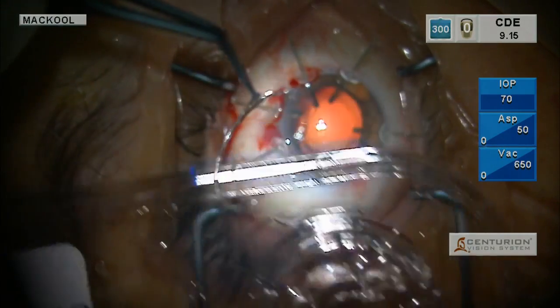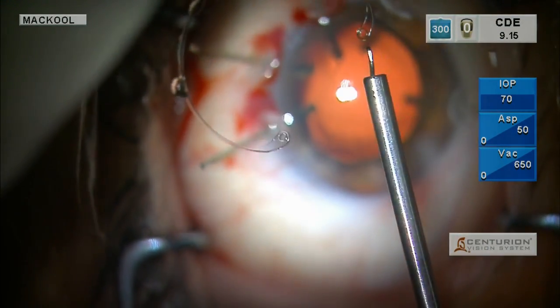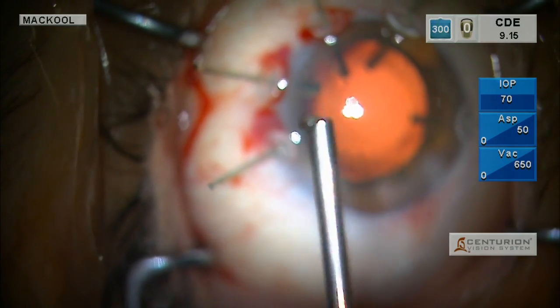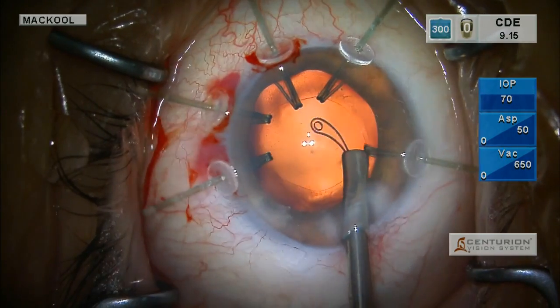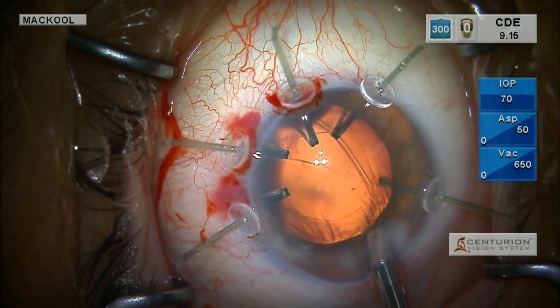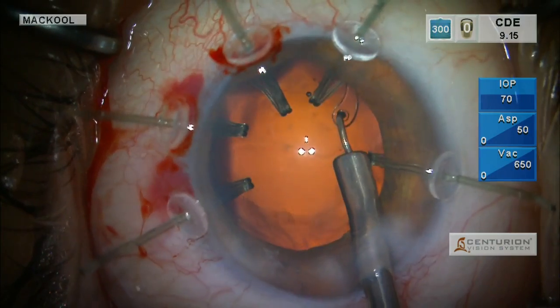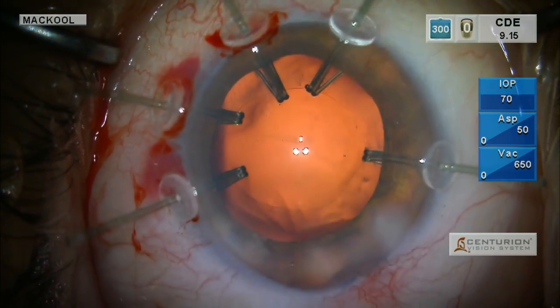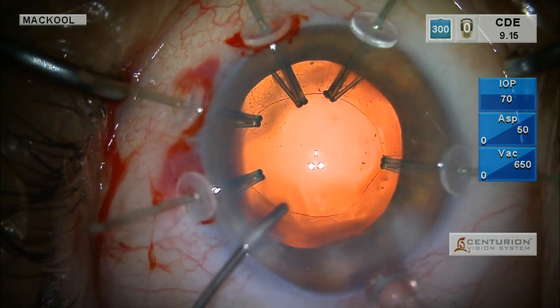There's the capsular tension ring with viscoat on it. I'm going to pick it up — the viscoat or any OVD holds it still so it doesn't fly away. I'm going to draw it into the capsular tension ring injector and inject it. The retractors will hold the capsule in place. I want to start it where there are no retractors, sort of in between them — I didn't want the edge of the CTR to go into one of the loops of the retractors, as that could cause a little trouble.